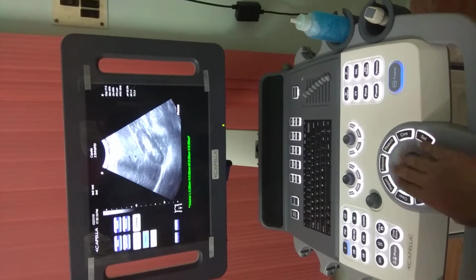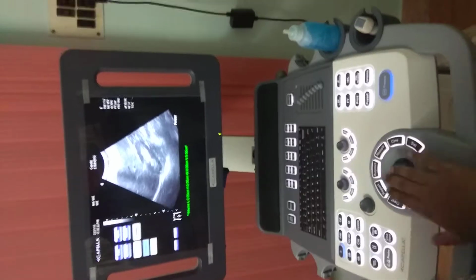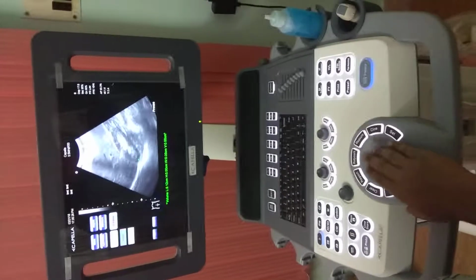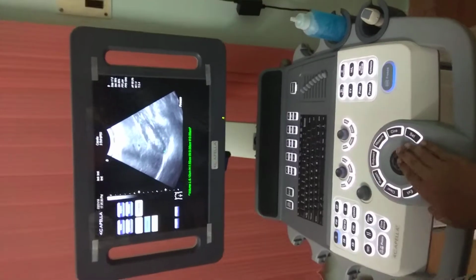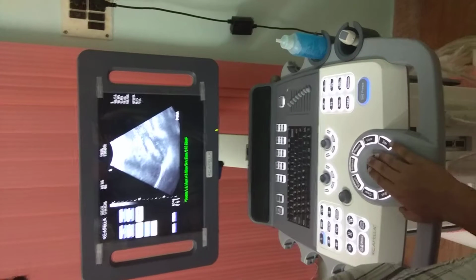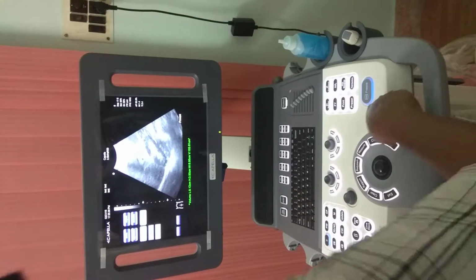We select volume. So there has to be 3 volumes. I'm just taking some dummy measurements to get the reporting done. These measurements or these values are not meant to be professional in order. So this is just a dummy measurement that we had made.